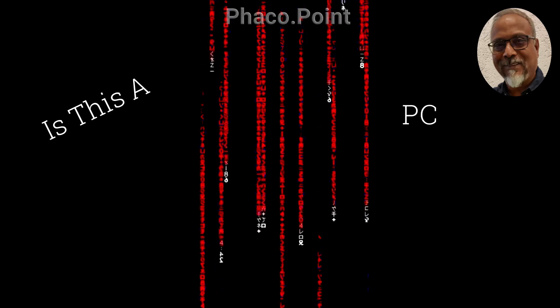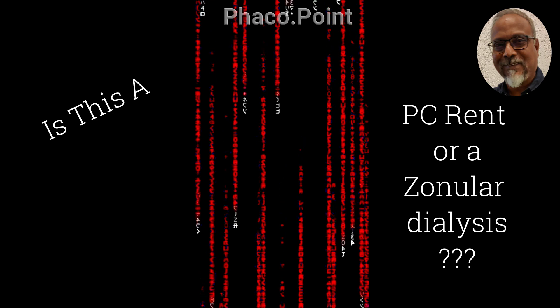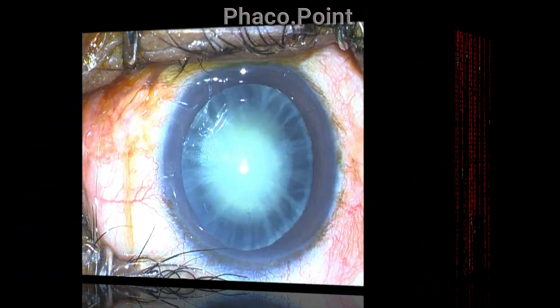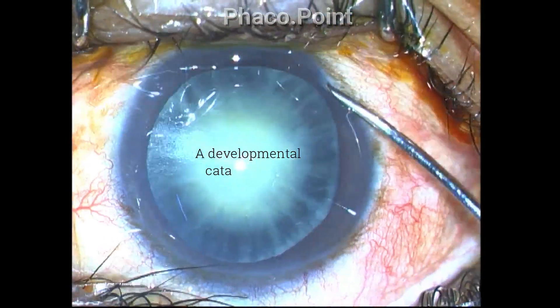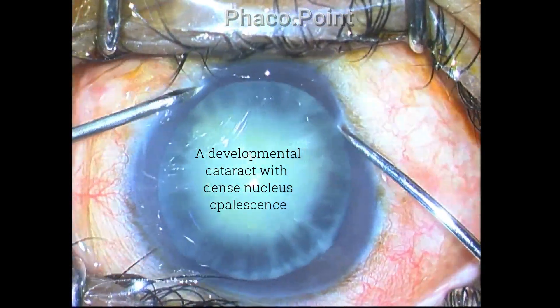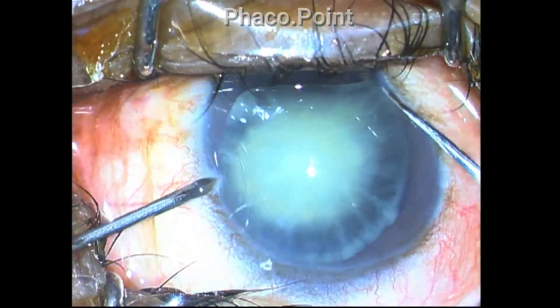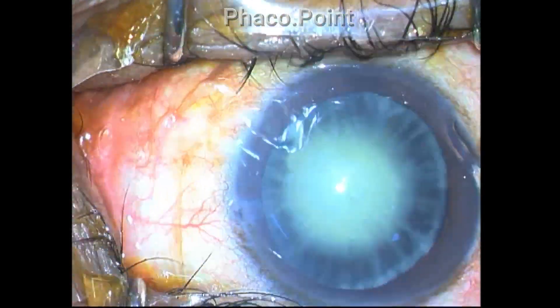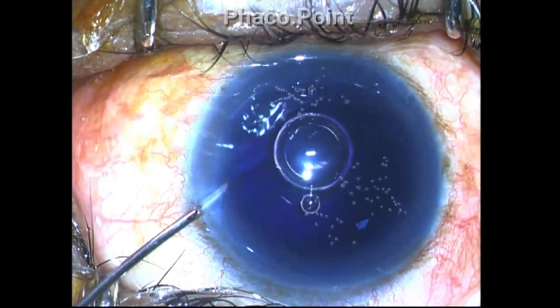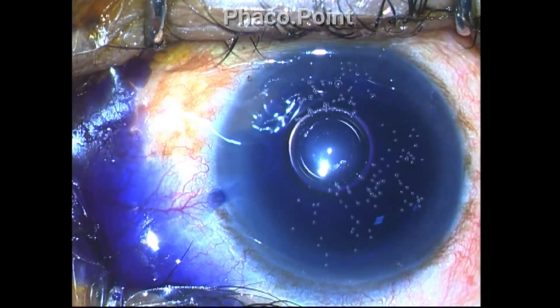Is this a case of posterior capsular rent or is this a case of zonular dialysis? This was the dilemma I faced when operating upon this developmental cataract, which had a dense nuclear opalescence in the center. Let's observe how the capsulorhexis as well as the nucleus disassembly progressed.